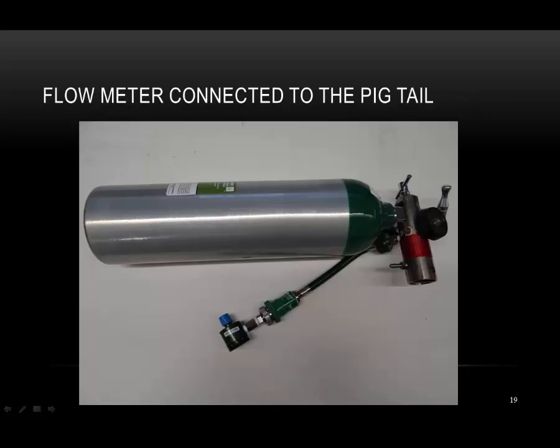Regulator-based, portable, non-invasive positive pressure ventilation systems generate continuous pressure from oxygen flow, directly controlling inspiratory and expiratory pressures. Regulator-based, non-invasive positive pressure ventilation systems allow different inhaled oxygen fractions, reducing oxygen consumption.